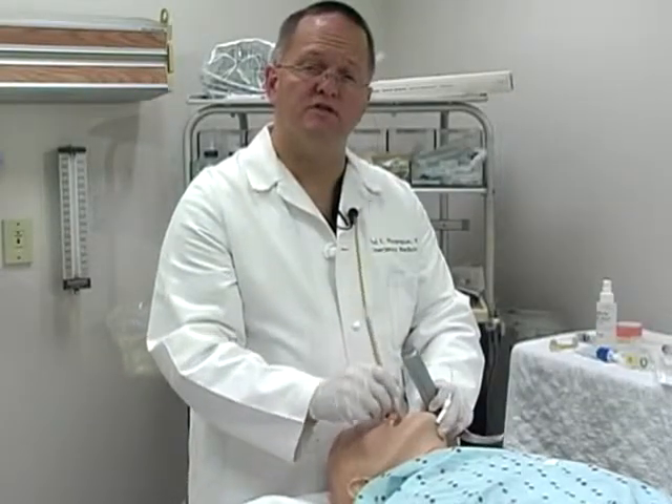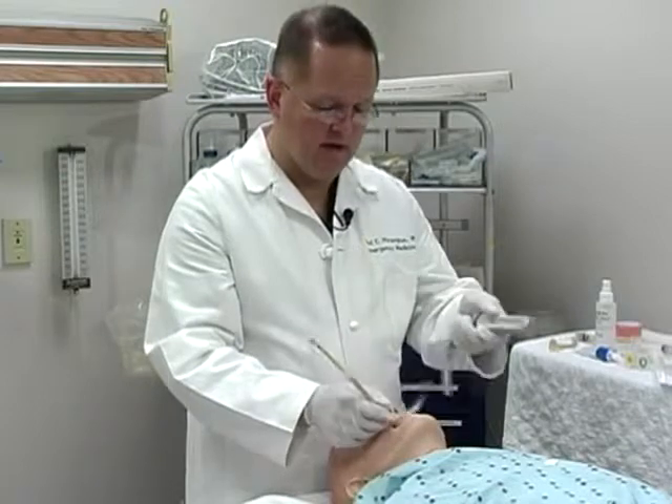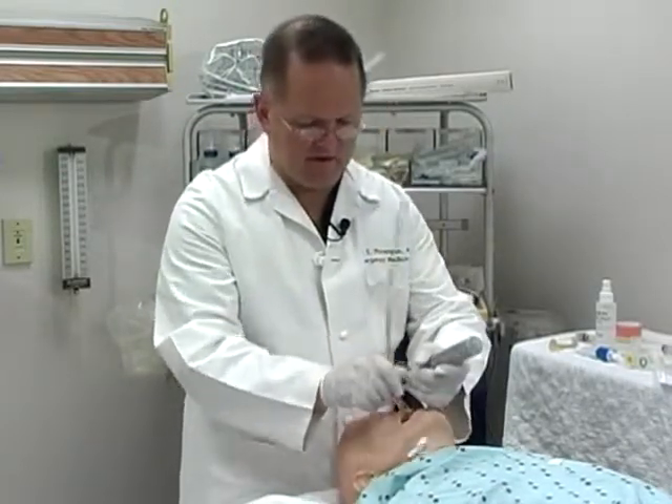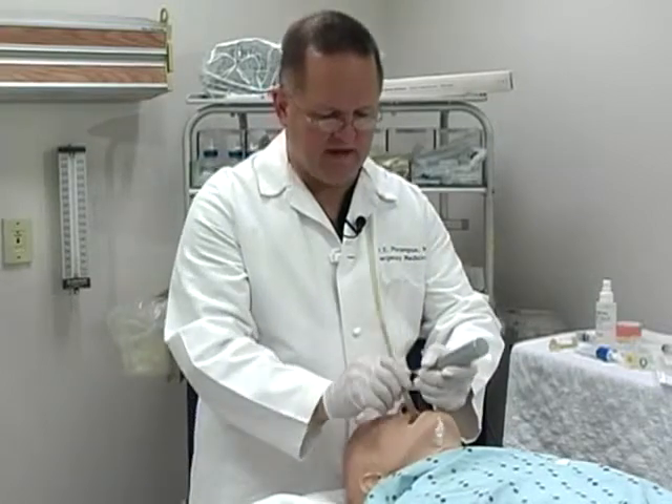To ensure that the tube passes smoothly down the throat. Once the tube is down near the entrance of the trachea, you'll feel a natural stopping point. At this point, you can use the laryngoscope to clear the structures of the posterior pharynx and advance the tube fully down the trachea.